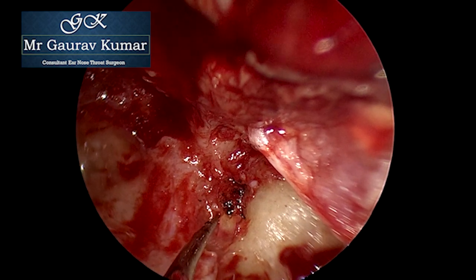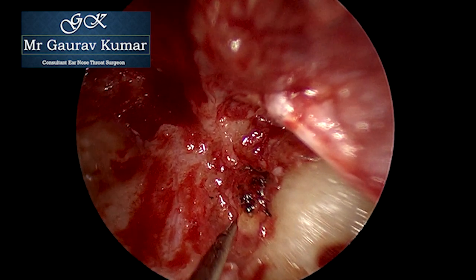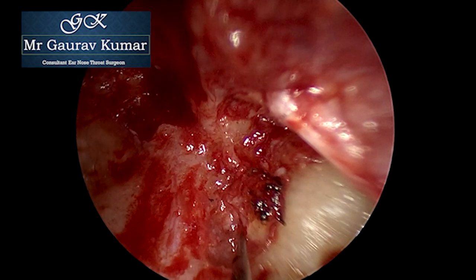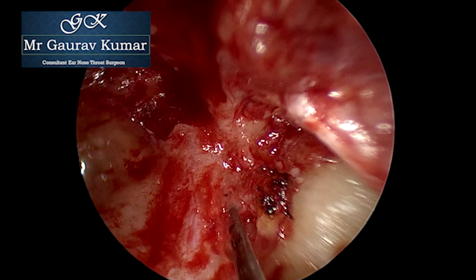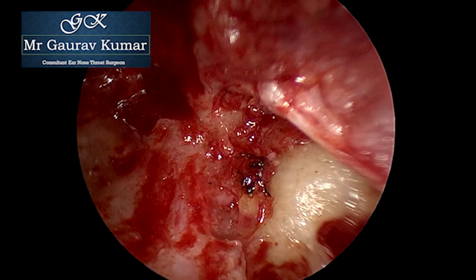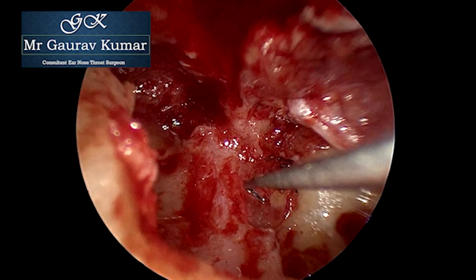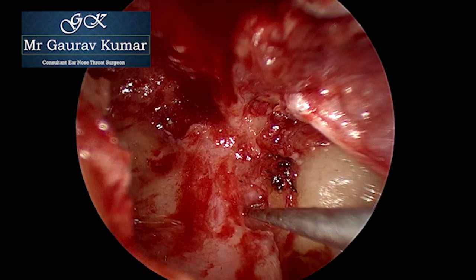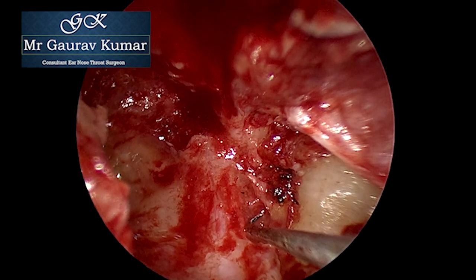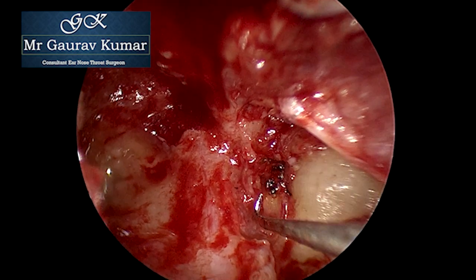The aim was to clean as much stapes as possible without dislocating it. At this point, I decided that we have done adequate dissection for the first sitting to be achieved safely. The decision was made not to reconstruct and to review the patient in a second look procedure, creating middle ear space.